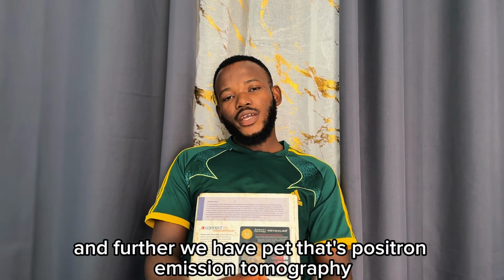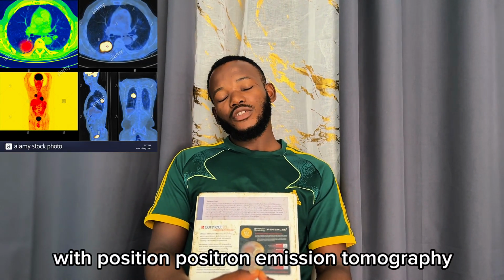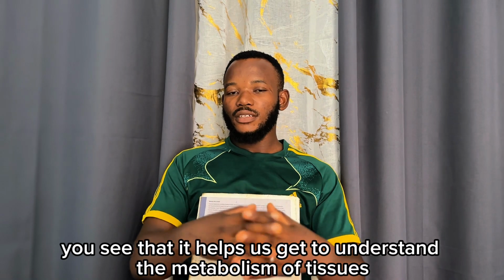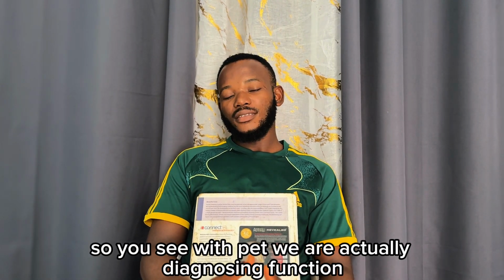And further, we have PET, that's positron emission tomography. With positron emission tomography, you see that it helps us understand the metabolism of tissues, how metabolic activities are actually happening within tissue. So you see, with PET, we are actually diagnosing function.